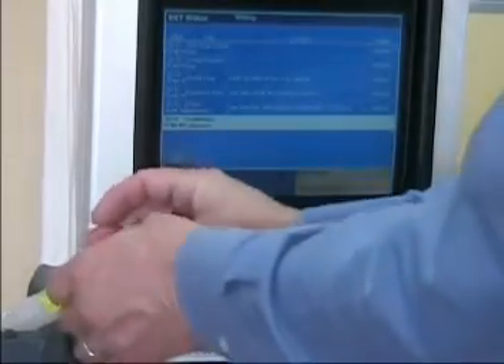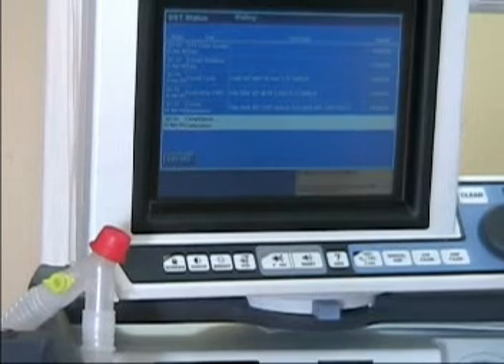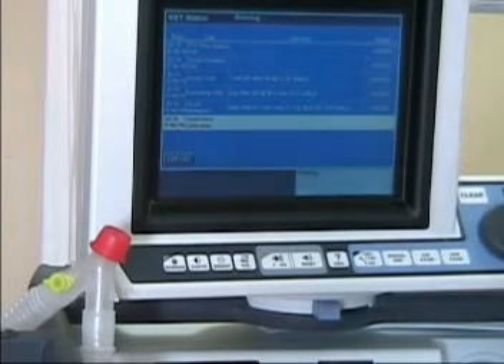It says block the Y, so we'll recap it. Press accept. It asks: is water in the humidifier? Press accept. We answer no, so it's going to test without water in the humidifier.